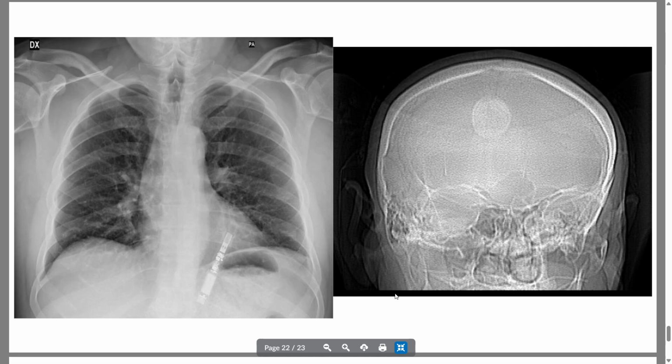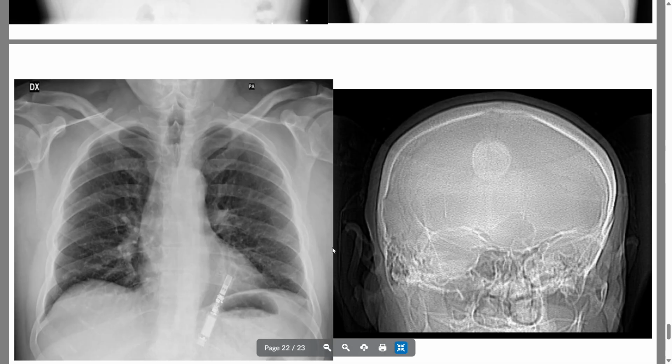You may be thinking this is a weird quality image. This is actually from a CT. It's a scout image. So it looks like an x-ray, just lower quality. It can help us localize where larger pathologies are. So if I'm looking at this and we're doing a head CT, I'm thinking, okay, that's weird. That looks like it could be a mass, but this patient also just had a ponytail, and this is their hair tie, encircled at the crown of their skull.